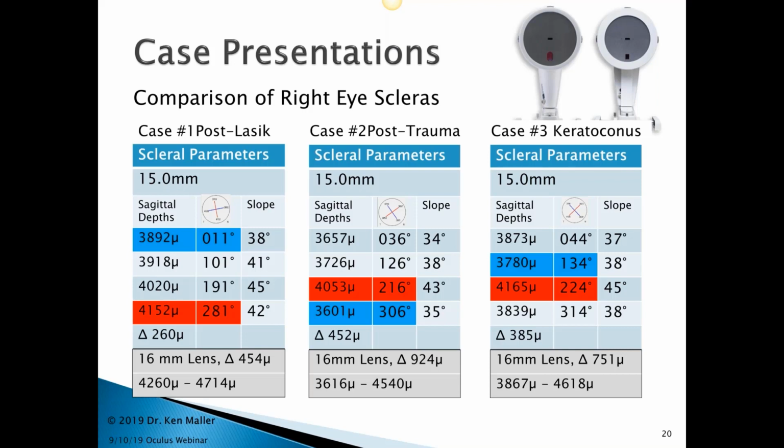Certainly with scleral lens designs, we absolutely positively are dealing with compromised tear films. And again, this data acquisition definitely takes a little bit longer. I'm able to get both eyes in their complete and good captures for the entire scleral data in probably about 8 minutes now, and I'm actually pretty efficient.